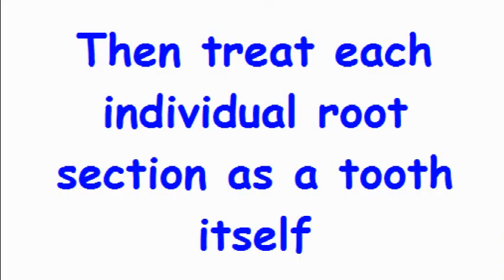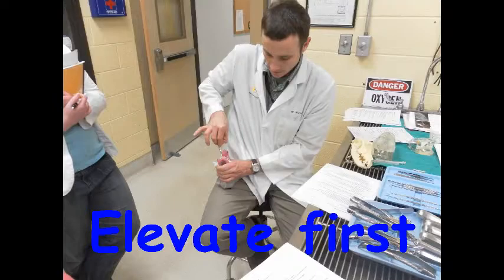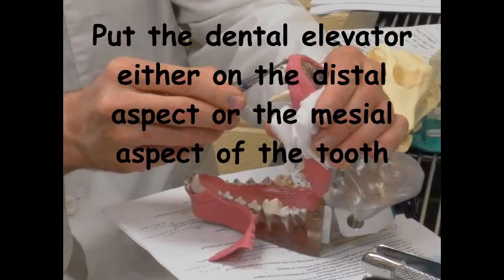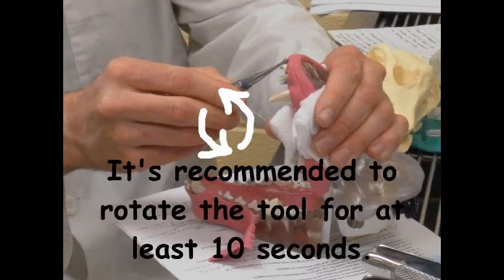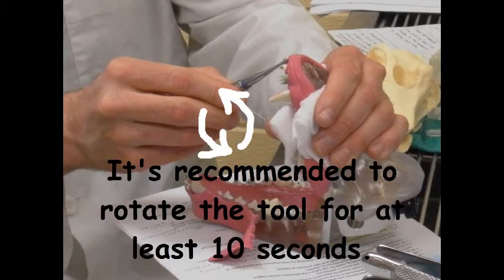But I pity the fool! Don't use a dental excavator! Treat each individual root section as a tooth itself. Remember, elevate first, not pull. Put the dental elevator either on the distal aspect or the mesial aspect of the tooth. Then you rotate the tool until the pressure breaks the periodontal ligament. It is recommended to rotate the tool for at least 10 seconds. Then you yank that son of a boop out!